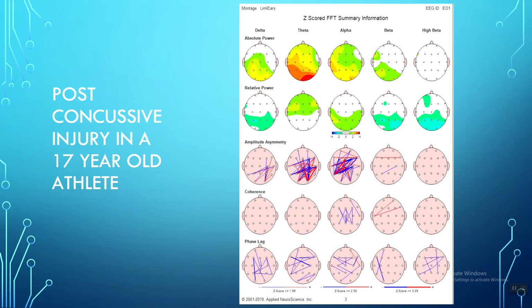So would that map, like in that case it was theta that was consuming it, but what if somebody was spending most of their time in delta, would that automatically show that? Then relative power would be trumping.